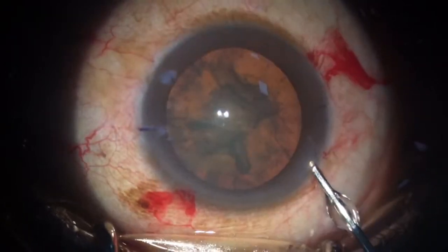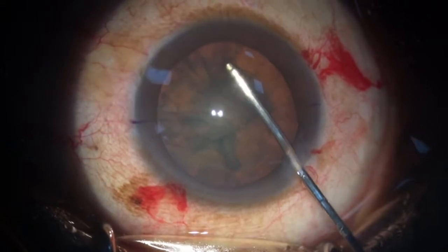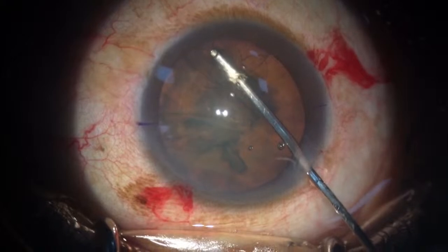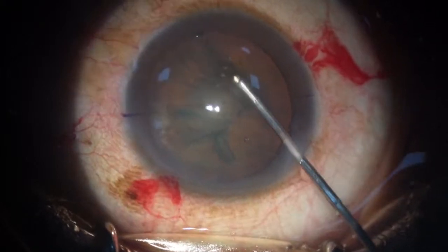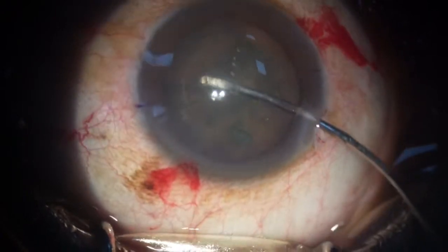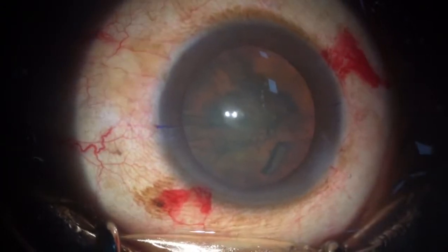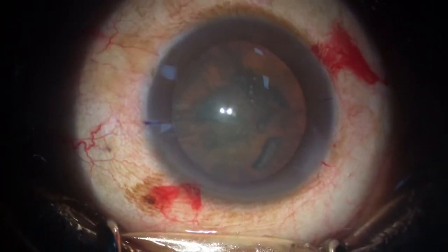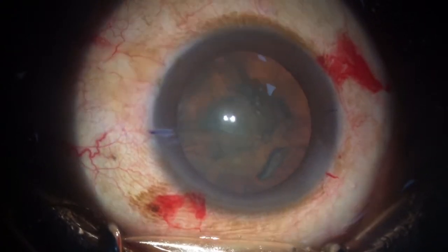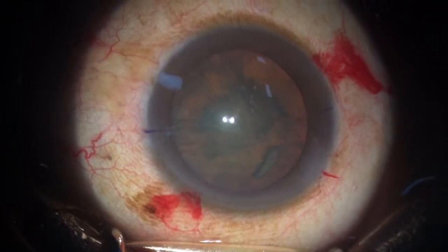For some reason. Okay, so let's see here. The thing is, with other syringes like Dispovan and all, it comes with a jerk, not like the glass syringes where you're used to it going in seamlessly, with a predictable push on the plunger. Anyway, it went now. So we're all set. I'm using again a Signature machine here.